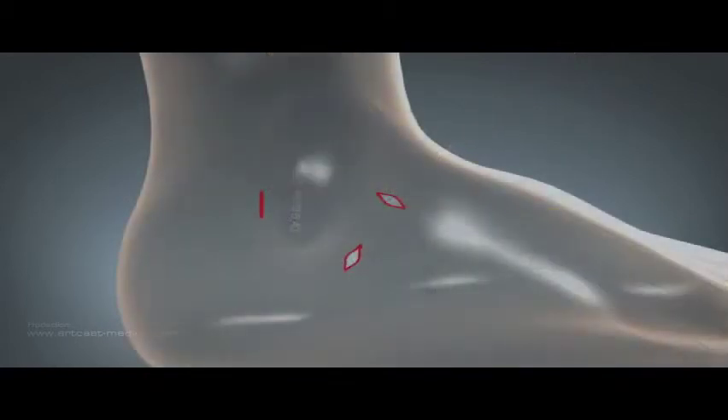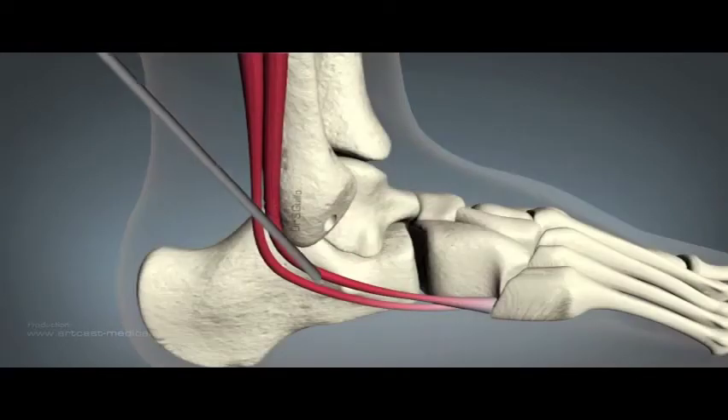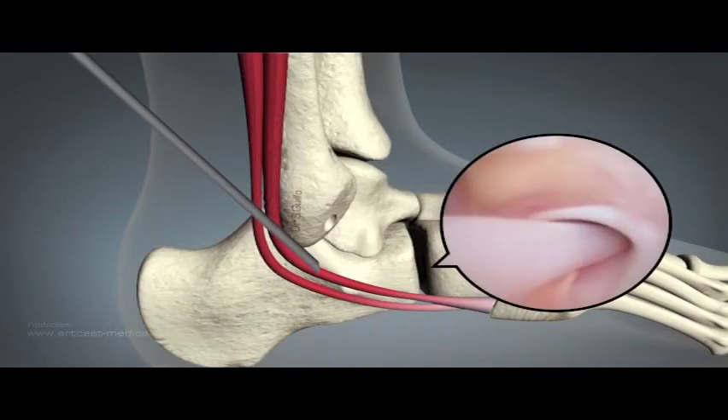From a peroneal tendinoscopy approach, the retinaculum is used as a landmark in order to identify the peroneus brevis. The bed of the peroneus brevis is debrided using a shaver from the inferior portal. This is loose synovial tissue and is easily cleared in order to identify the CFL remnant.